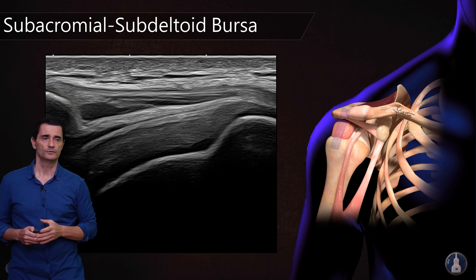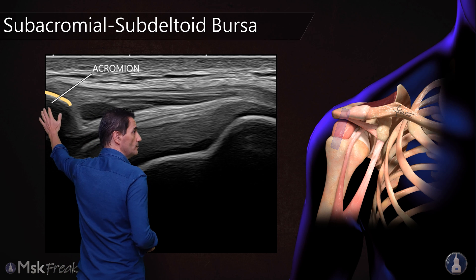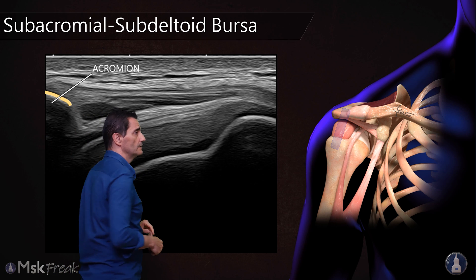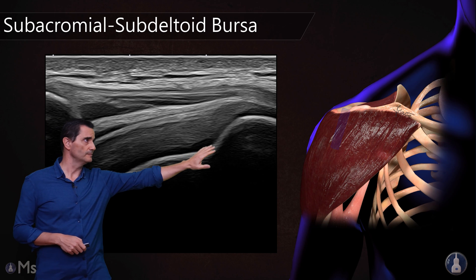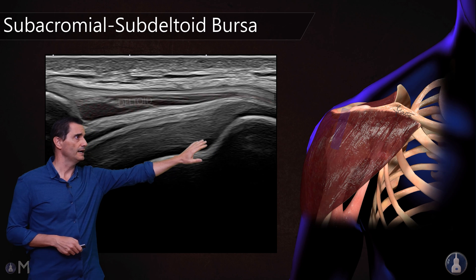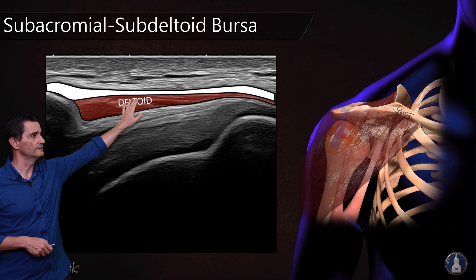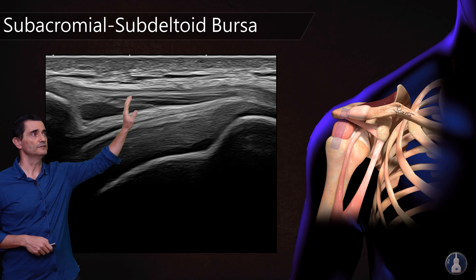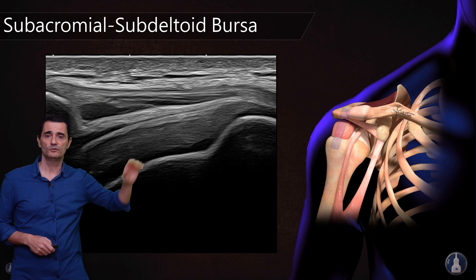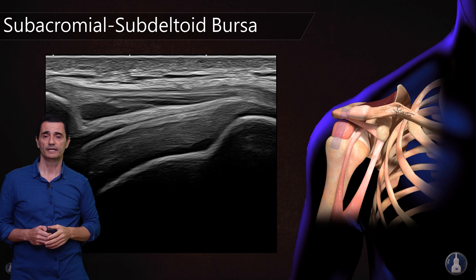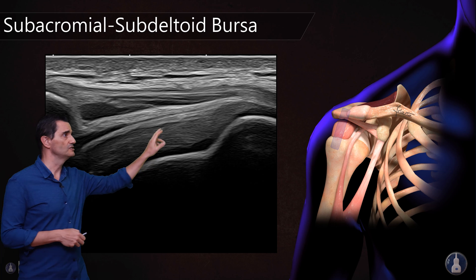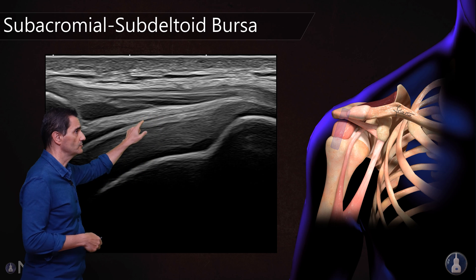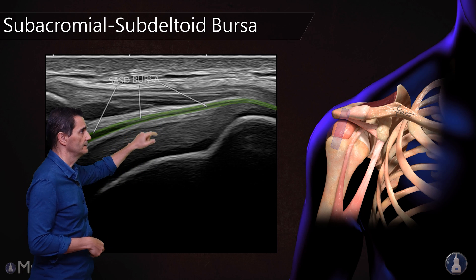Remember that the subacromial-subdeltoid bursa will be located between the deltoid and the supraspinatus. So this will be the acromion at this level, and this will be the deltoid muscle located here. Between the deltoid and the supraspinatus will be located the bursa, and you can see it with ultrasound like this double hyperechoic line here.